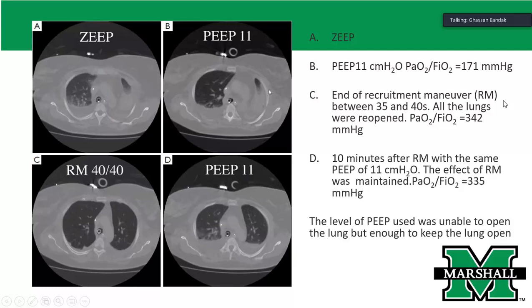They increased the PEEP to 11. They did not achieve much recruitment in the almost fully atelectatic lung. They might have inflated more the partially atelectatic lung, and that may be harmful in certain situations because it may have caused hyperinflation of that functional part of the respiratory system.